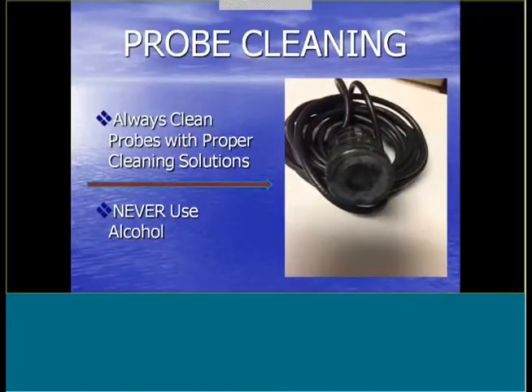Okay, the other thing I want to talk to you about is to remember that you always clean your probes with proper cleaning solutions made specifically for transducers. Now, this isn't a monitoring probe here. This is a diagnostic probe, but you can see how the probe looks like it's got a cataract. You never want to use alcohol. Alcohol definitely destroys the membranes of these probes. Avoid alcohol if you can, because with long-term use, you're going to get something like this. Okay, so clean these probes with Transeptic spray. A lot of these companies have come out with little towelettes that are safe for probe cleaning. Try to avoid alcohol at all costs.